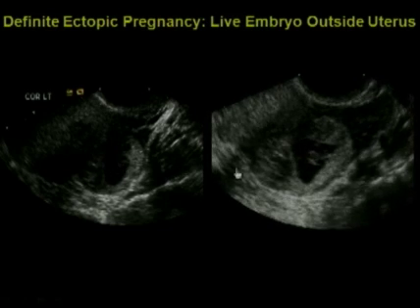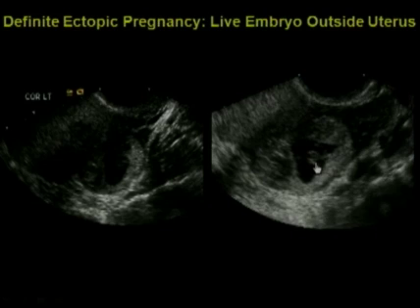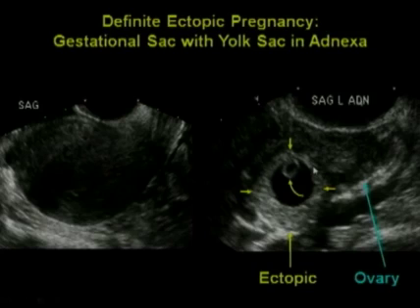And how do we know it's an embryo? Because on this companion video, we can see there's a heartbeat inside. So this is not just a probable ectopic pregnancy, it's a definite ectopic pregnancy because we're seeing a live embryo outside the uterus. Here's another definite ectopic pregnancy.